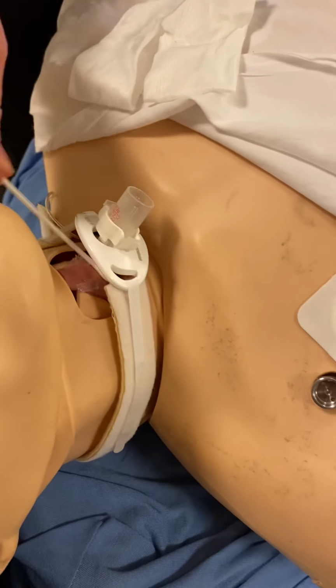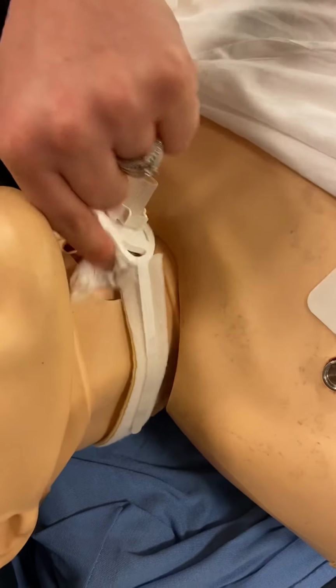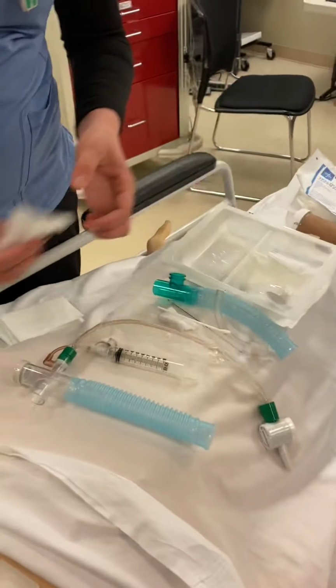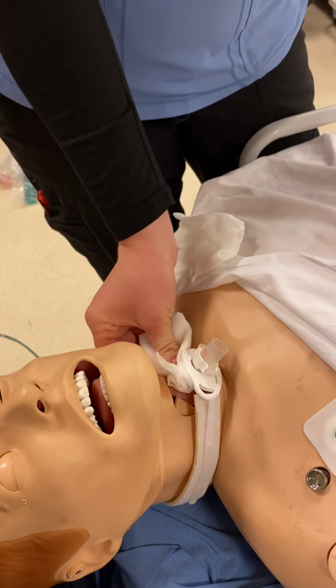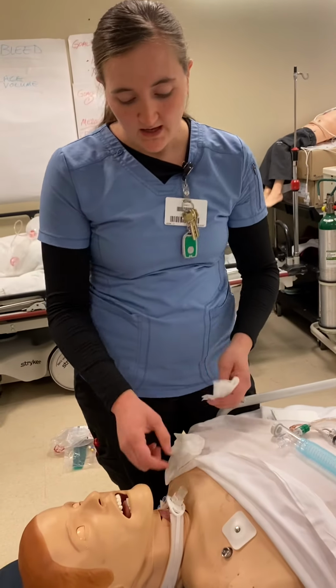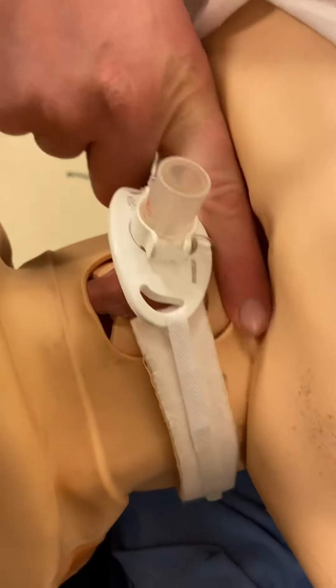You're going to rub the stoma, get all the junk, blood, secretions out around it, discarding these, and then you'll get a dry one, and you'll want to dry that stoma. The reason why we want to keep this nice and clean, one is for bacteria, so we don't have infections, but also we don't want any skin breakdown. It's really common that patients get skin breakdown right here at the bottom of that trach, and so that's what we want to be mindful of.